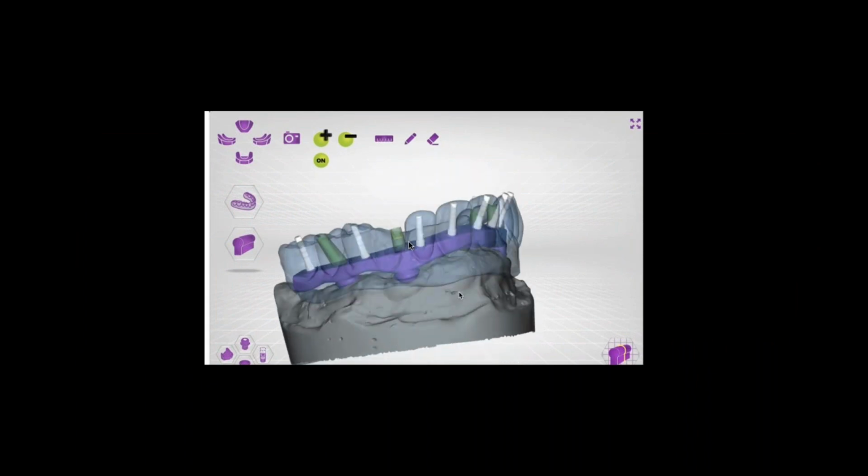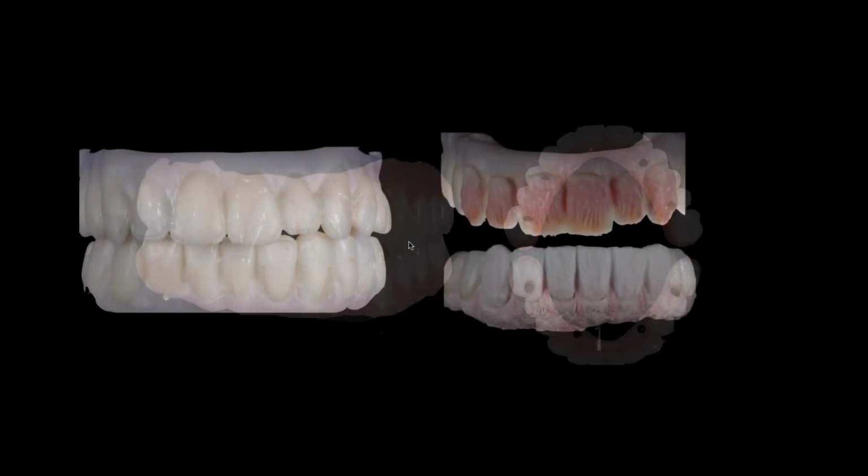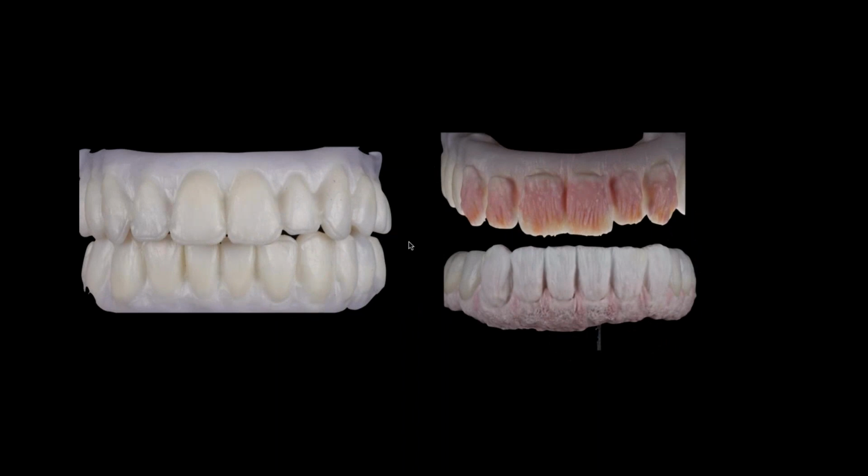And again, I've walked all the way through this before, so I don't have to go through it again. We're going to make him final dentures, and yes, it was 4 on 4 on both upper and lower arches. We'll place the implants. Now, this could have been a crown and bridge case, and I would have treated it very much the exact same way. We chose to go with a Toronto restoration for this.